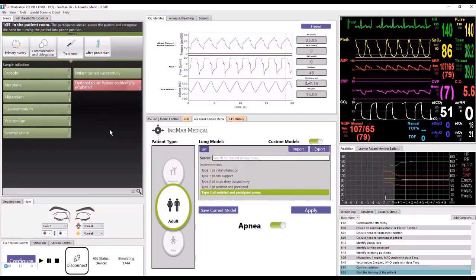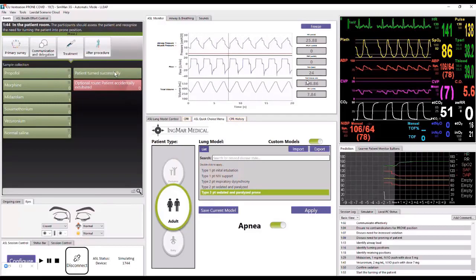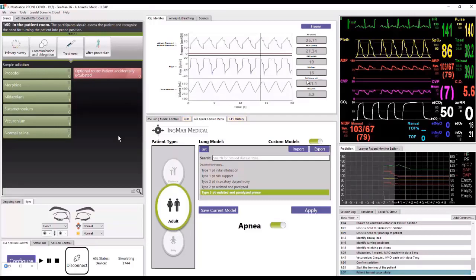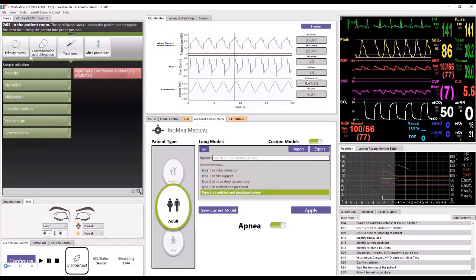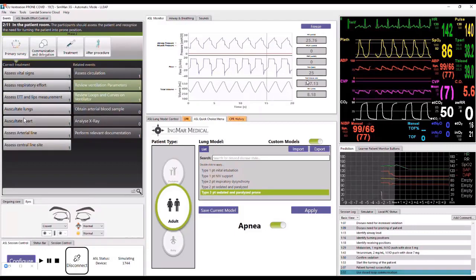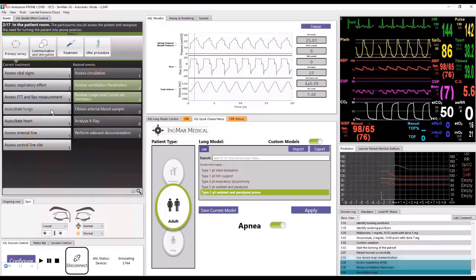Once we click off patient turn successfully, there is that slight moment of some hemodynamic instability, and we're not looking for a rapid change or rapid improvement. It's, as Jess said, something that happens over a period of time. As they're going through the scenario, they would most likely do another reassessment of the patient to see how they're stabilising after the movement of the patient.